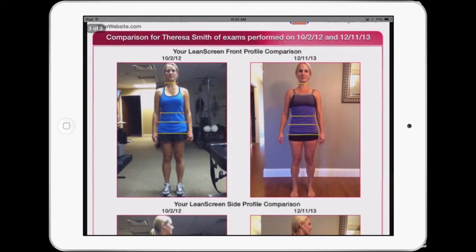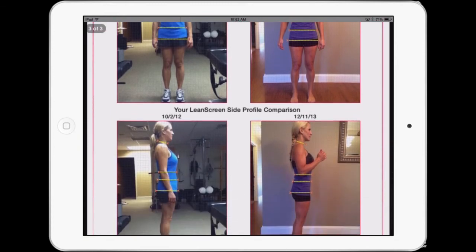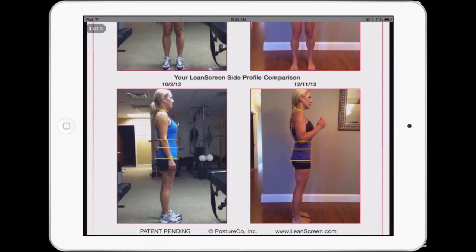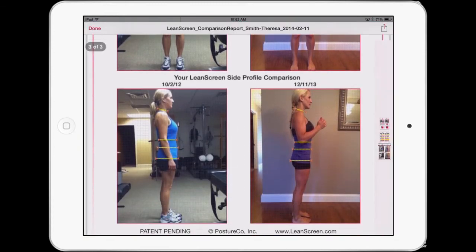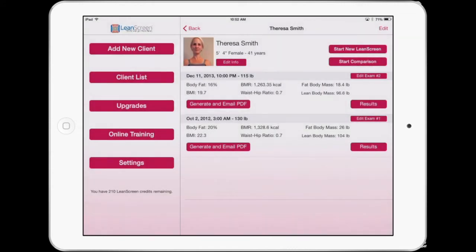Then of course you can see the photographs of before and after. This is available in LeanScreen, the standalone app, and LeanScreen is also available within PostureScreen Mobile. The comparison module within the PostureScreen version will be coming out very shortly, but it's available now in LeanScreen.